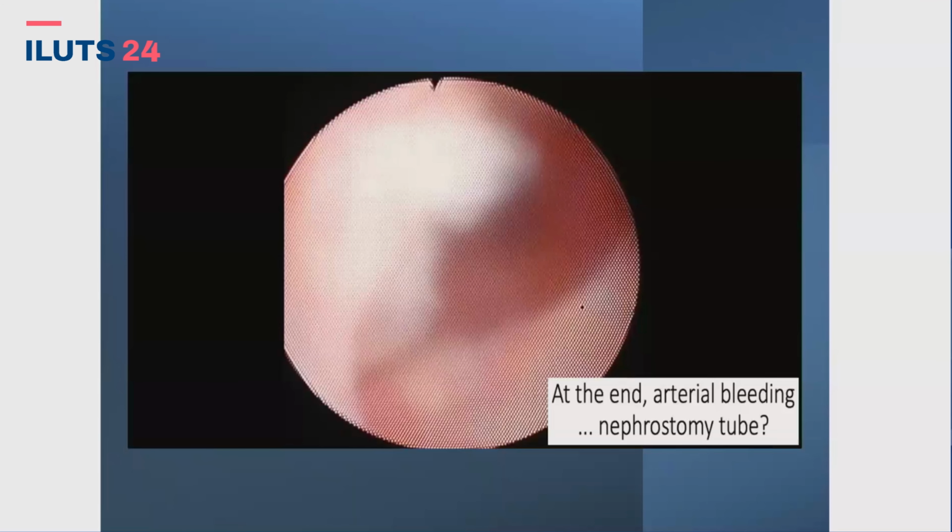Yeah, but in this case, it's arterial bleeding. Okay, I agree with Marcos that it's a little bit of a magnification of the visions because it's a small vessel, but you can see that the jet is powerful enough to have a good bleeding. So keep going with the video.